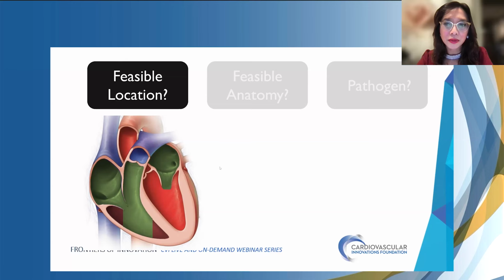Yeah, thank you, Sanjam. It's a great point because we really need to see where exactly in the subvalvular space it is, is it the chords or the papillary muscle, how far deep into the RV. And in terms of views, like any tricuspid imaging, from the mid to distal, but I find most particularly in the subvalvular, going to the transgastric and deep gastric are really the best views.